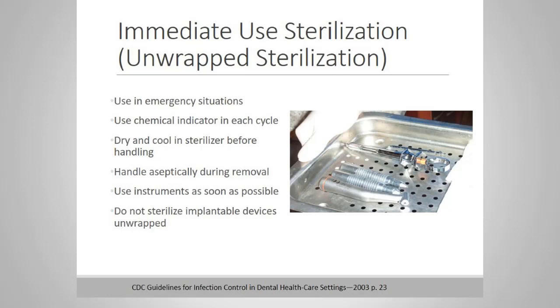So in other words, this is only an emergency situation. If you use unwrapped sterilization cycles, make sure that you have a chemical indicator within the cycle. Dry and cool in the sterilizer before handling. Handle aseptically during removal. Use the instruments as soon as possible, and never store instruments unwrapped, and do not sterilize implantable devices unwrapped.